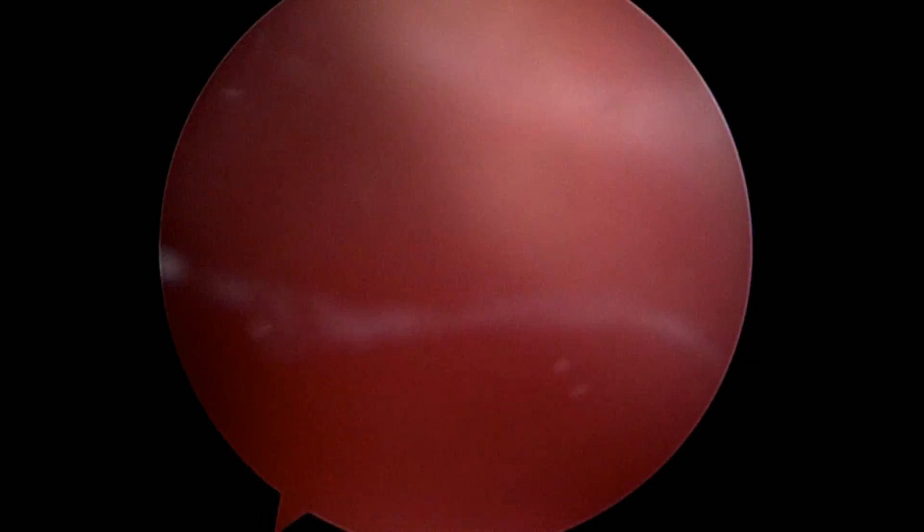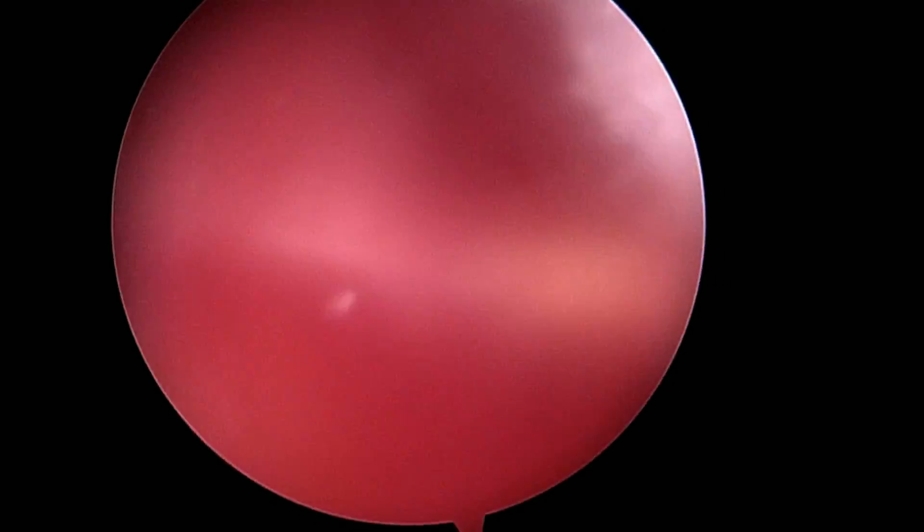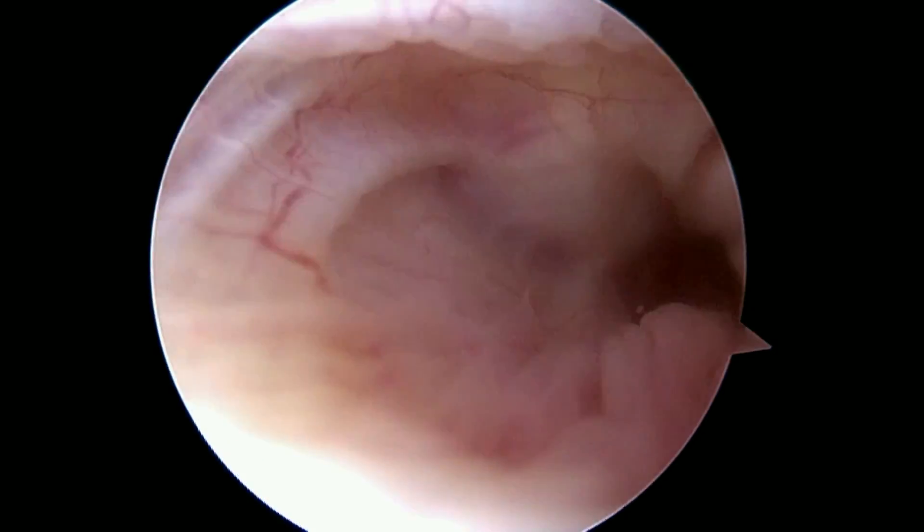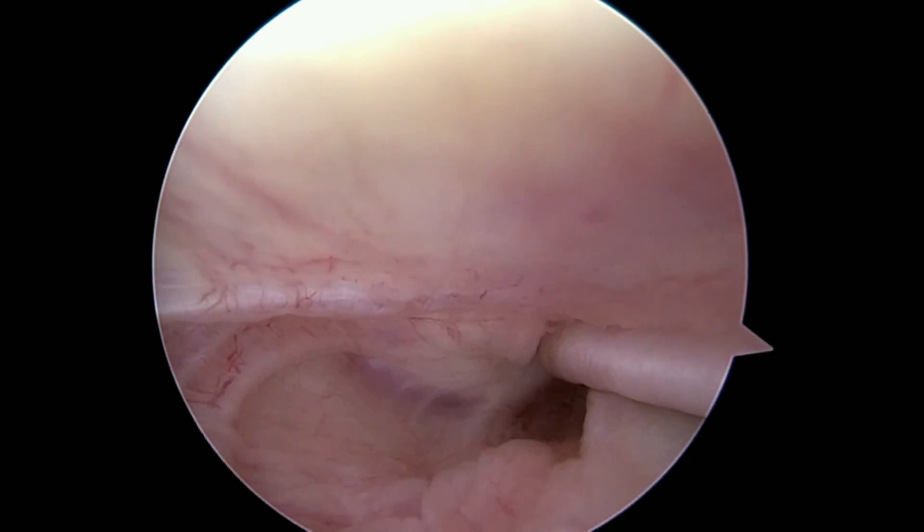If there's anything else interesting on the video to show you, we'll come back up on the video. That's the medial gutter. Otherwise, we'll be done with the arthroscopic portion of the case and we're going to get to work on doing the injection next. This is the lateral gutter that we're looking at way down here, and that looks clear. I just want to make sure to film this. I really hope this does the trick for you. Good luck to you now. Bye-bye.